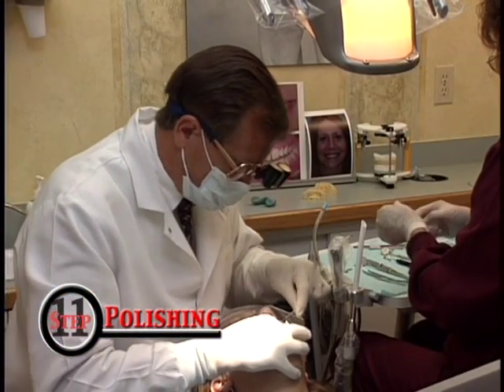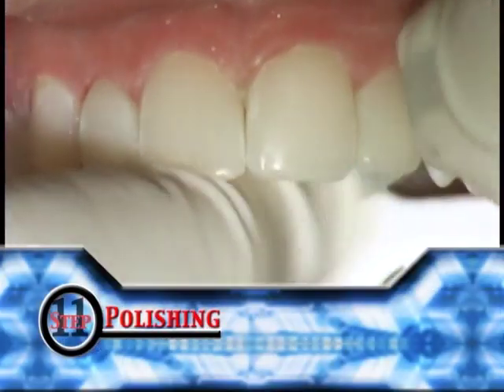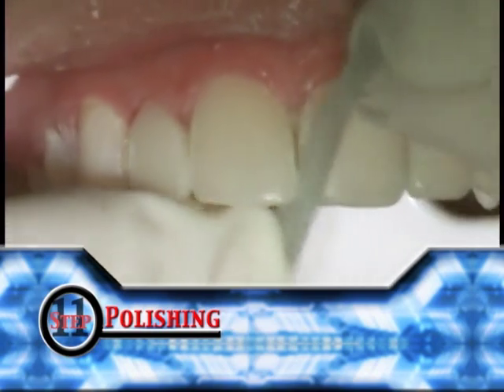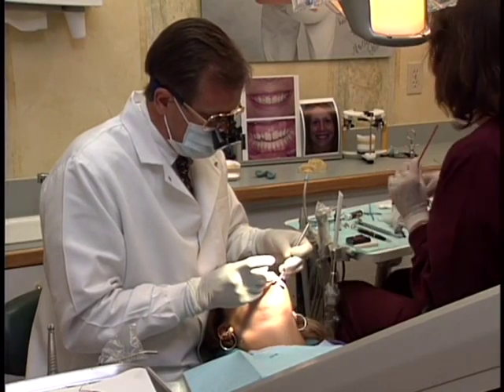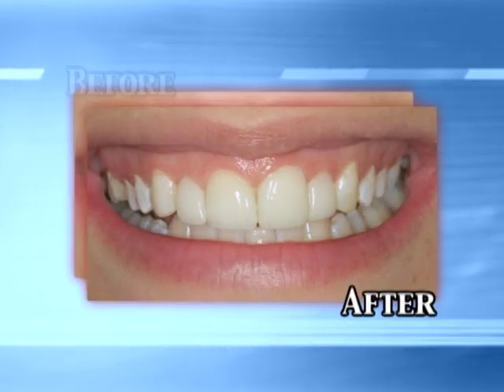You will finish with the Epitex sanding strip manufactured by GC America to polish in between the teeth. This is particularly important so stains will not stick to rough areas between the teeth. This case is completed by checking the occlusion and lateral excursions. We find both to be free and clear, which is another benefit of using a silicone index and a wax-up in the procedure.